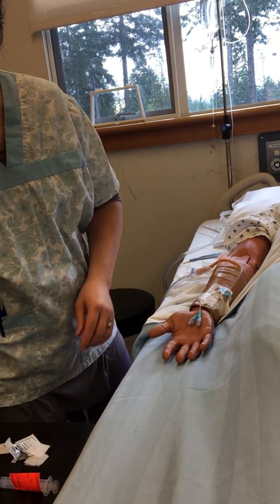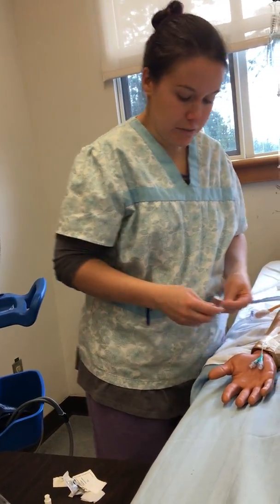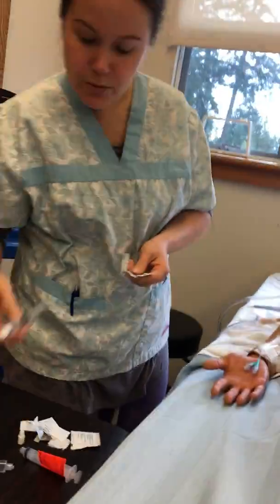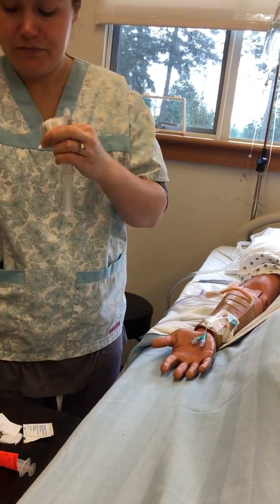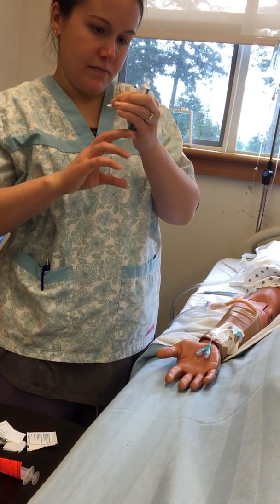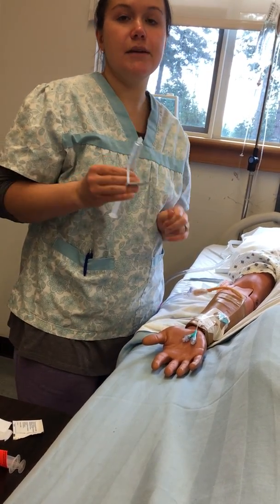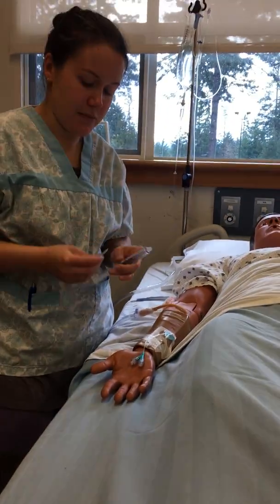Now there may still be some medication in this little tubey thingy. That's the technical term, tubey thingy. And so I need to, when I attach this PosiFlush, which I'm gonna get the air out of, and then when I attach this, for the first 2 milliliters of this, I'm gonna put it in at a very slow rate again, 2 milliliters over 1 minute.